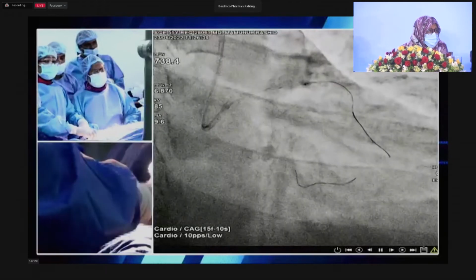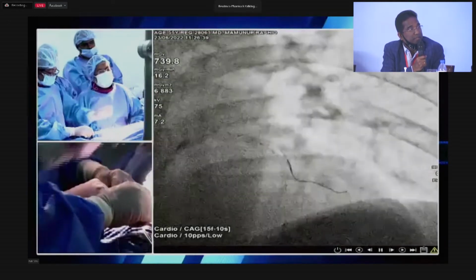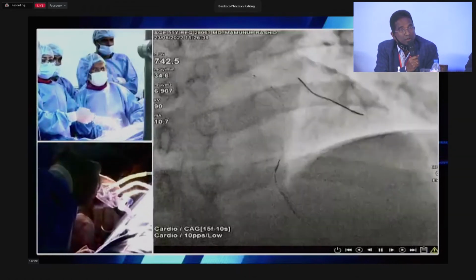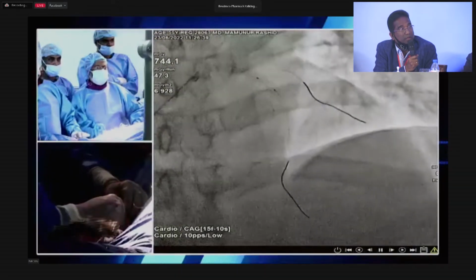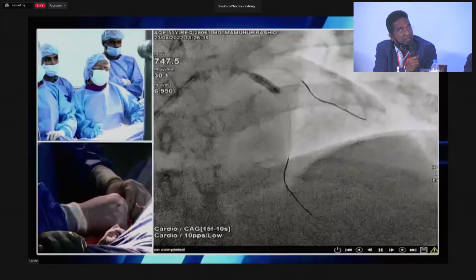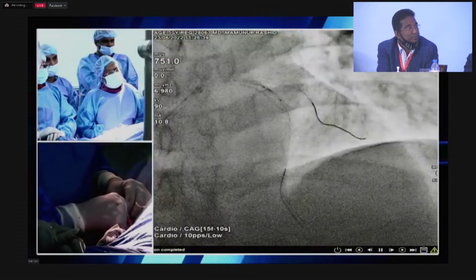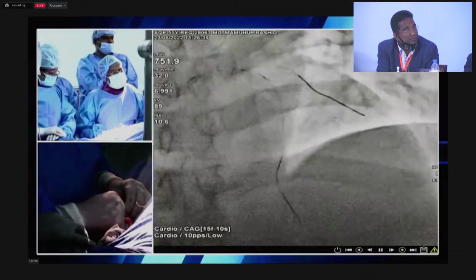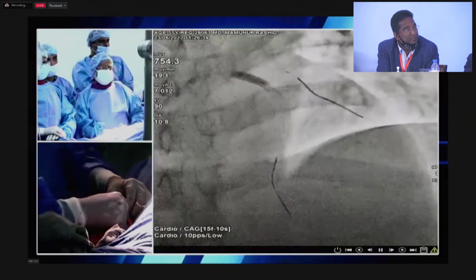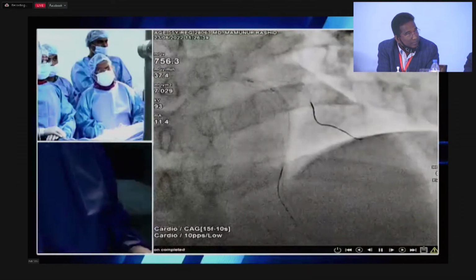You recross the LCX wire in which strut? For the fellows, if you told the strategy to recross, how will you confirm the distal strut or non-distal strut? What is the strategy to confirm that your recrossing wire passes through the distal strut? As we know, other than a crush technique, in most of the cases, we should cross distally. And to cross through the distal strut, it is wise to do it with a double lumen catheter or with a micro catheter.